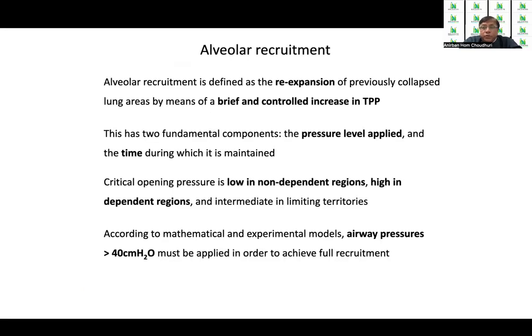So whenever you apply the open lung approach, it needs to recruit the alveoli which were so far less exposed or participating less in the gaseous exchange, and this is achieved through the process of alveolar recruitment. Alveolar recruitment is defined as re-expansion of previously collapsed lung by means of a brief and controlled increase in the transpulmonary pressure.